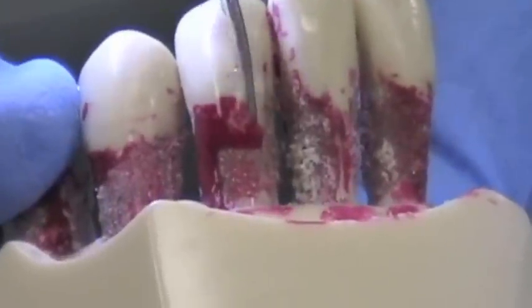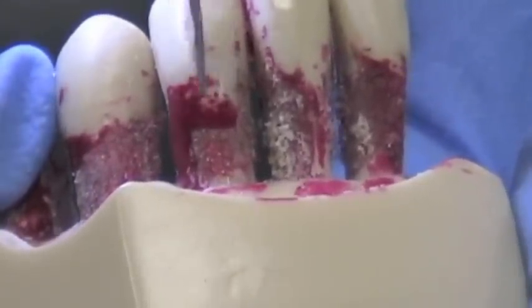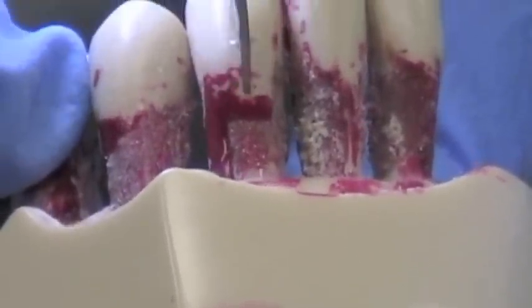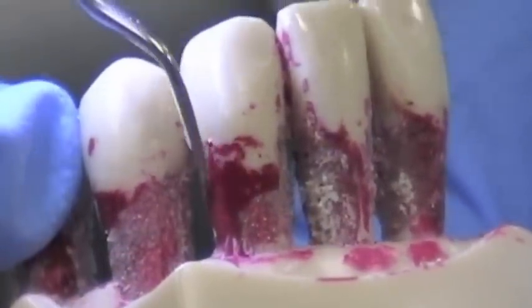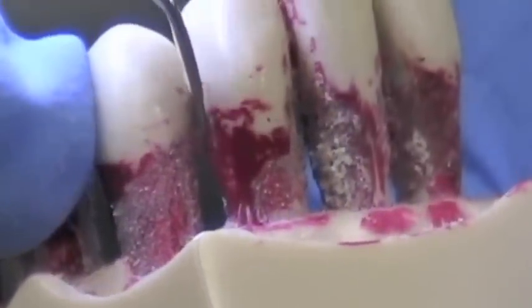Again, you're using that same sweeping action — kind of a slow, methodical, criss-crossing, very, very light pressure. This tip in particular, let the tip work for you. These are diamond coated instruments, and you really do have to have a very, very light touch.